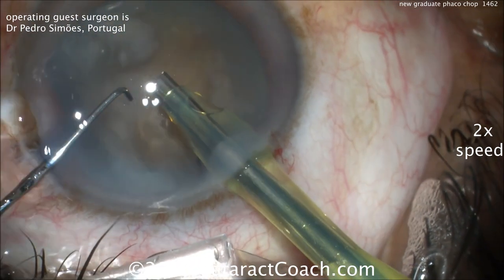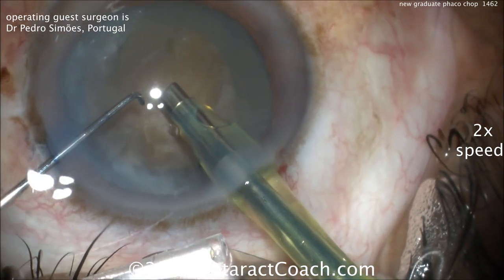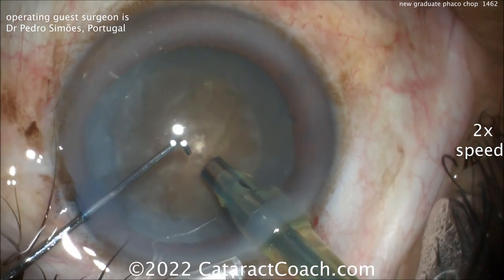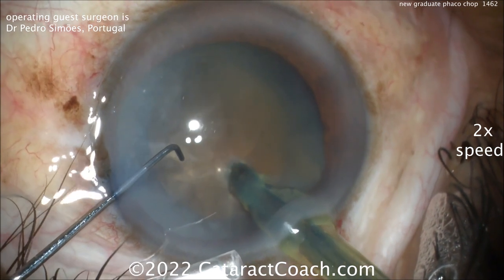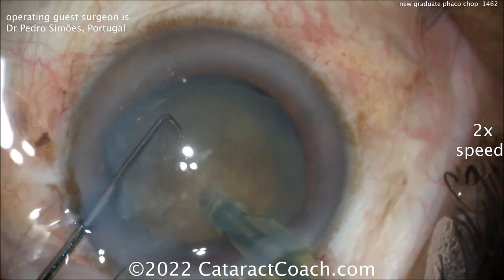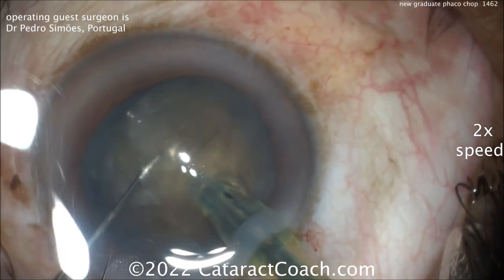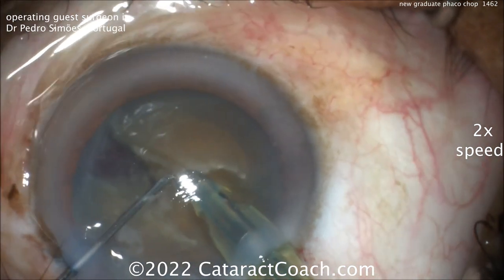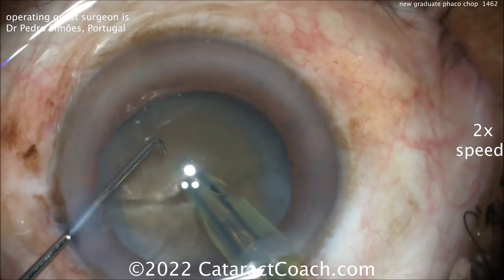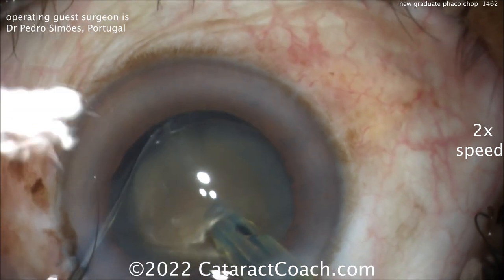Faco probe going inside the eye, and let's see the technique here — cleaning up some of that lens material. Looks like a vertical chopper. Faco probe going nice and sub-incisional space, nice and deep, and a combo chop — so kind of horizontal, kind of vertical chop. Very nicely done. Good separation. Didn't fully propagate because it's a very dense, fibrous nucleus, so rotate 90 degrees and then chop again.